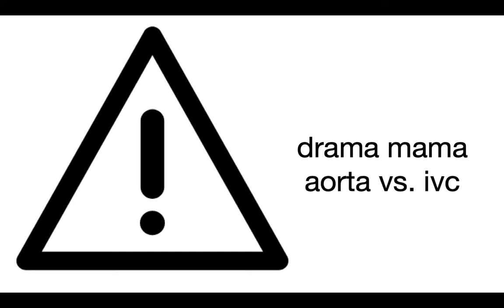Next is don't confuse the aorta for the IVC. The two structures sit right next to each other in the body, and the IVC also changes with respiratory variation, so looking at pulsatility alone is not sufficient. That's why I hyperangulate upwards, because I want to see the IVC going directly into the right atrium, and I try to visualize both so that I know I'm not confusing one for the other.